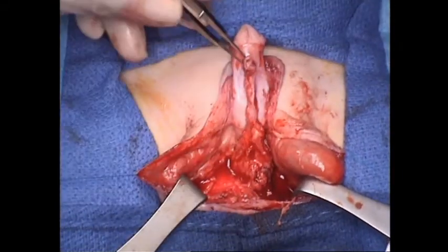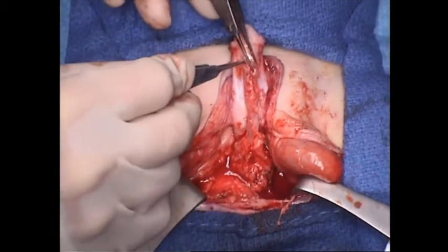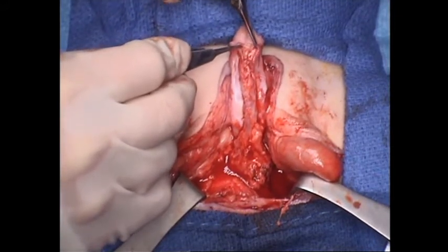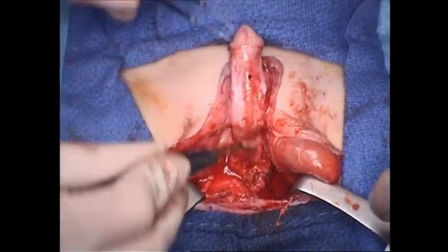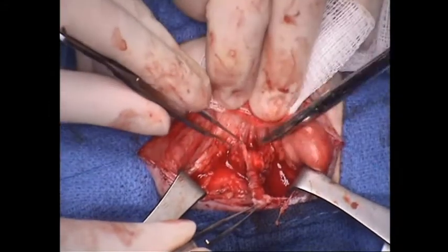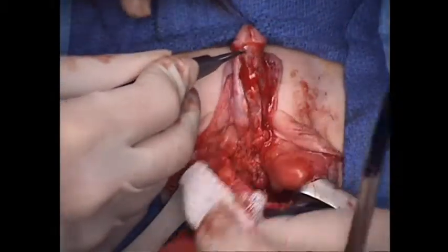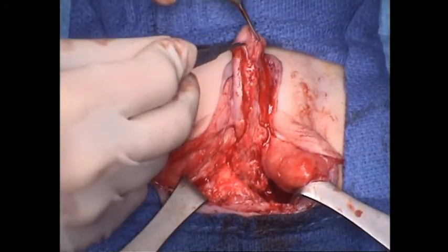go. So that gained a significant length. So recall, when we first transected, I couldn't lift the urethra beyond here. Now we can lift it almost back up. Now that still is not what we're going to do for our repair, because remember, we have to address our corporal disproportion and lengthen our foreshortened ventral surface on the penis. And so this is not going to reach back up once we do that. But it's certainly higher than it was.